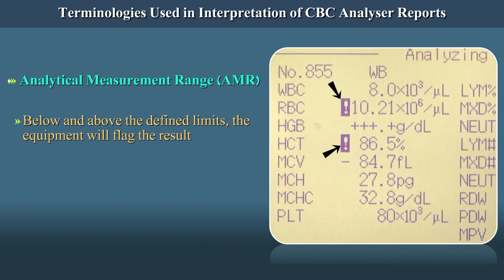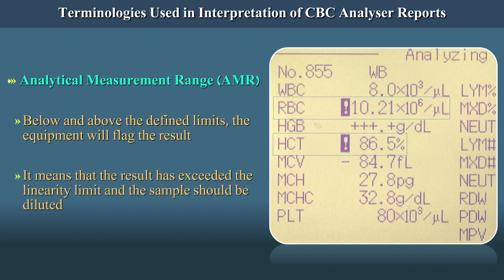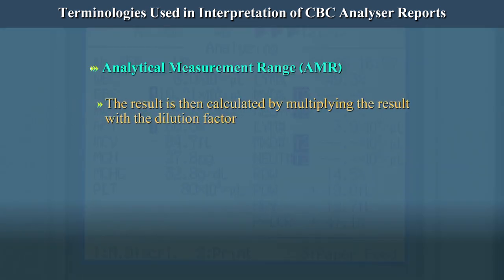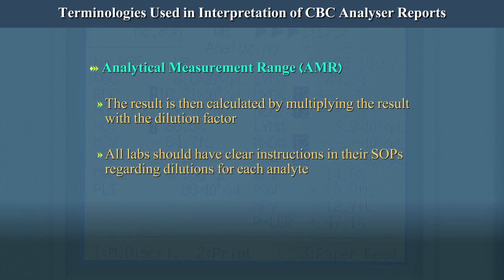In this case, an exclamation mark flag means that the result has exceeded the linearity limit and the sample should be diluted for upper ranges exceeding the AMR. The result is then calculated by multiplying the result with the dilution factor. All labs should have clear instructions in their SOPs regarding dilutions for each analyte.